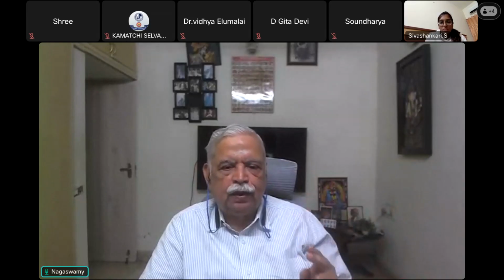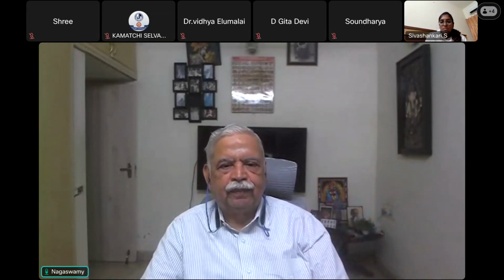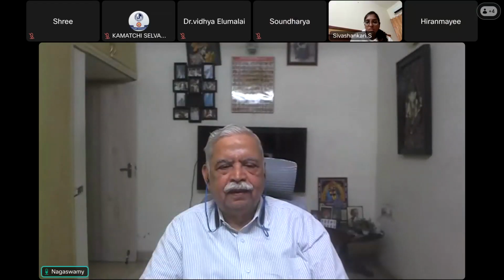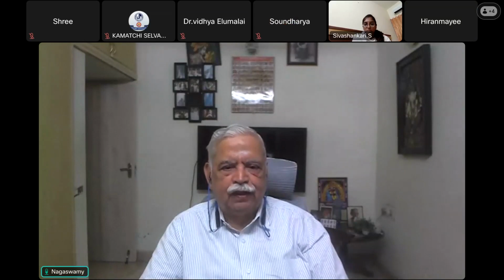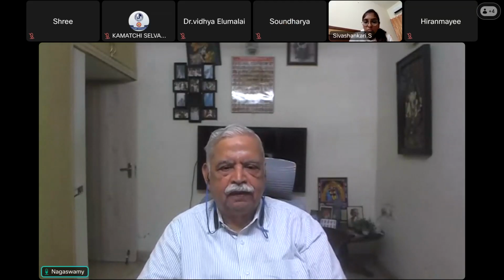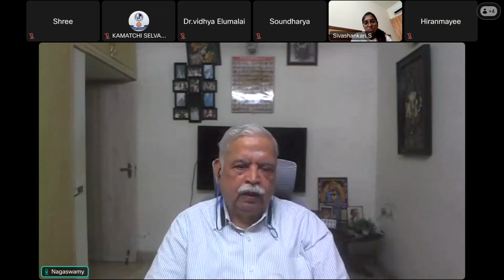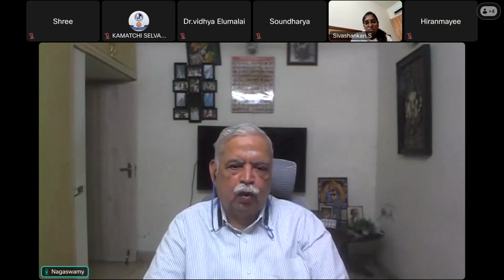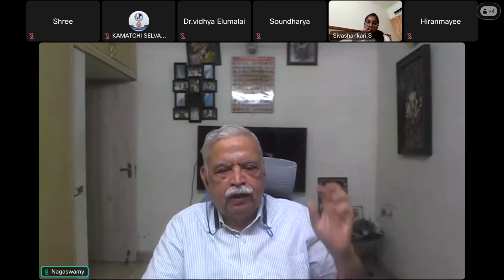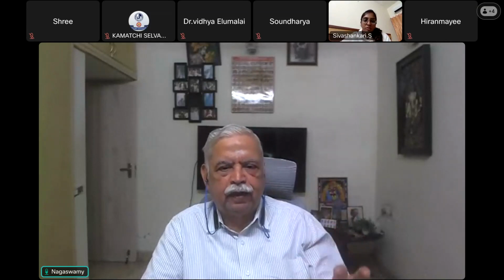What are the two factors which are going to govern the delivery of gases to the patient? Airway resistance, sir. Airway resistance and compliance of the alveoli and chest wall. Okay, these are the two basic things which you have to remember. One is the airway resistance, second is the compliance. If the resistance increases, even when you set a volume delivering mode or volume control mode, if there is a bronchospasm, all the airways become narrow, will the volume be delivered? No, sir. No. So there you require a pressure support or a pressure control ventilation.